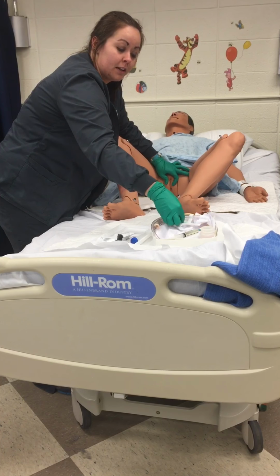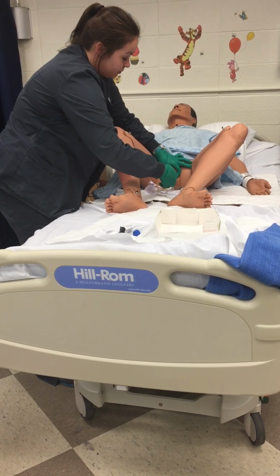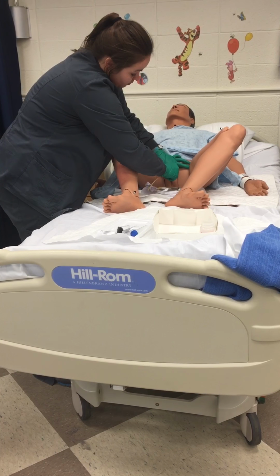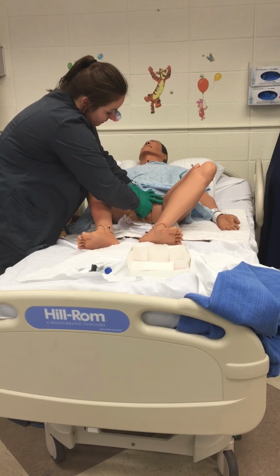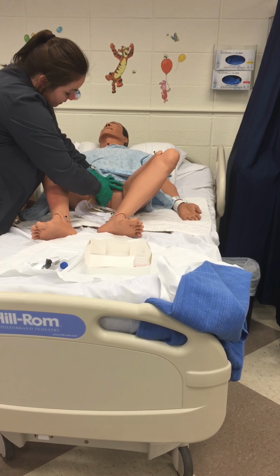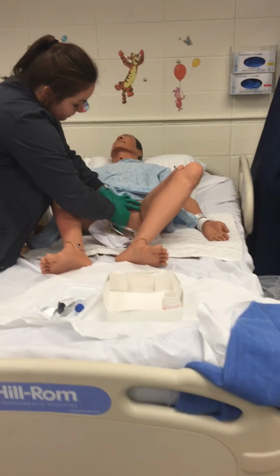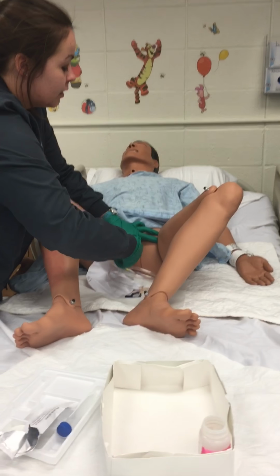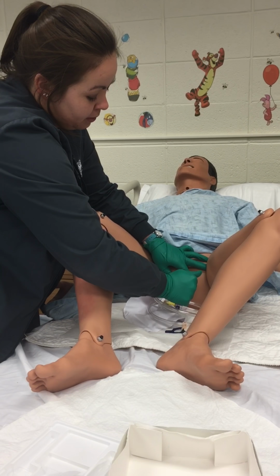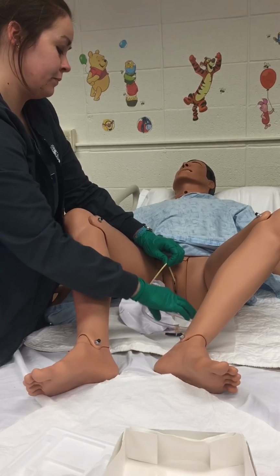I would then take my Foley kit, my lubricated tip, insert my Foley, until I see urine return. I would insert another inch or so, inflate the balloon on the catheter and then pull back until I met resistance.